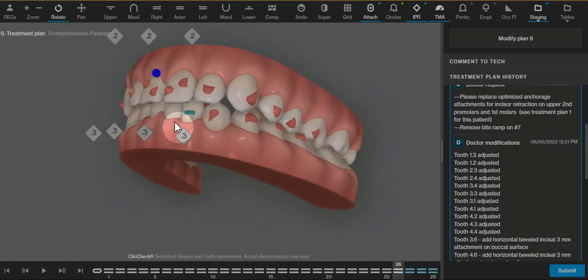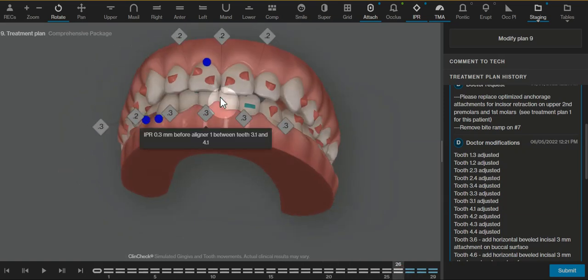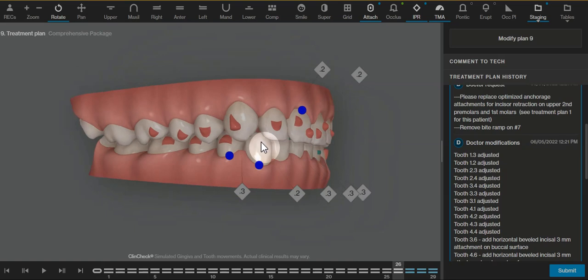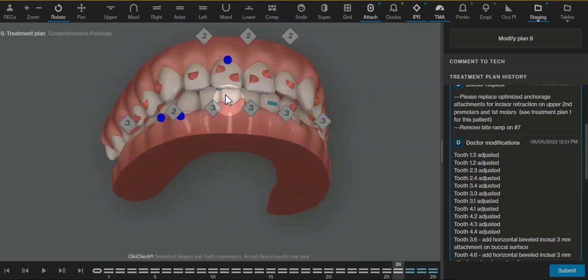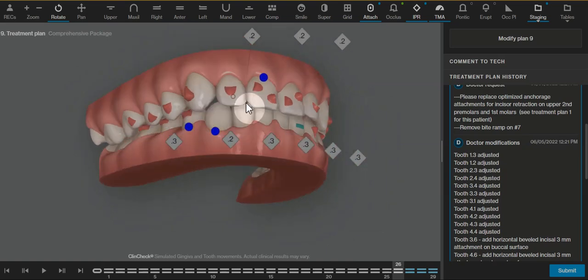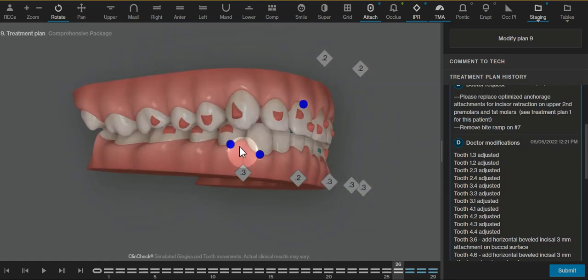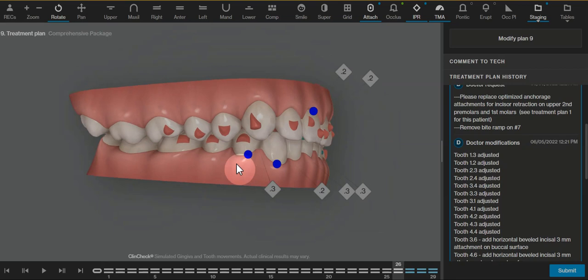This is a ClinCheck that is set up to just close all of the spaces and leave a sufficient amount of overjet to expect it to function well without having a posterior open bite from an anterior interference.